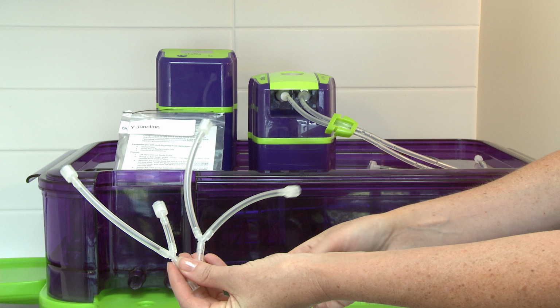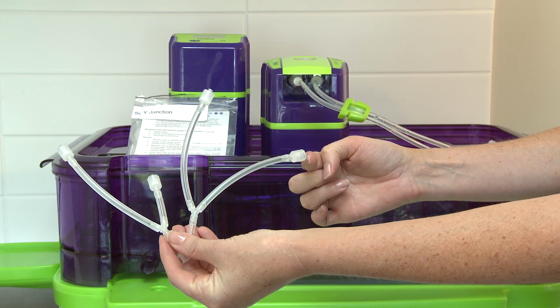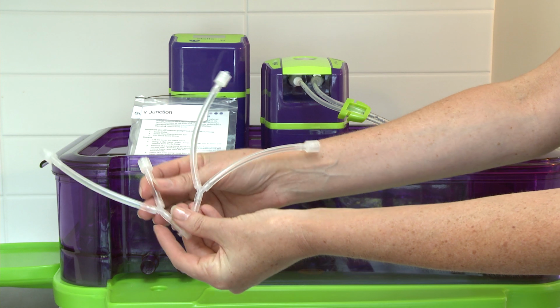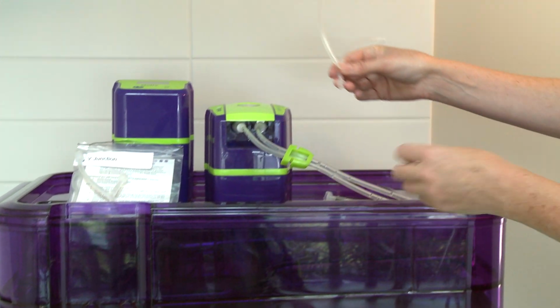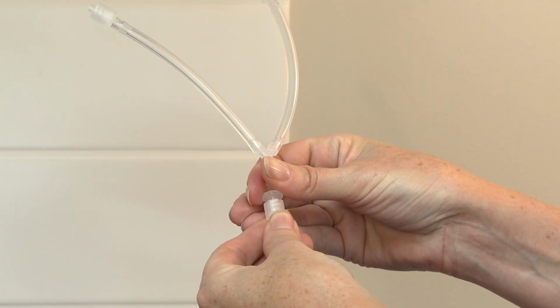Some instruments have 2 fixed ports that feed into the same lumen. Both port entries must be disinfected. Check the instrument manufacturer guidelines for how these 2 fixed ports should be disinfected. If the instrument is single lumen with 2 entry ports and it is determined that both fixed ports must be disinfected, the dual Luer lock connector Y-piece can be used to split the Stella Pulse tube set connection to attach to both ports.